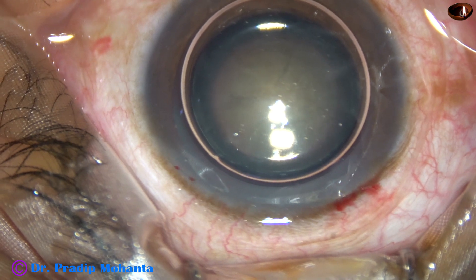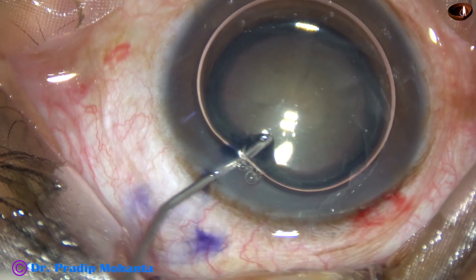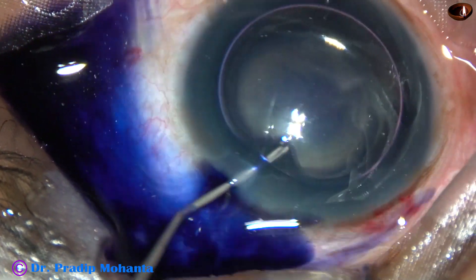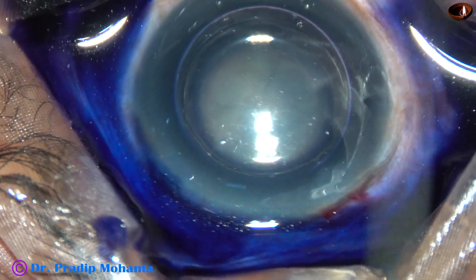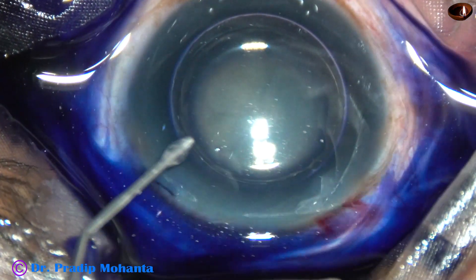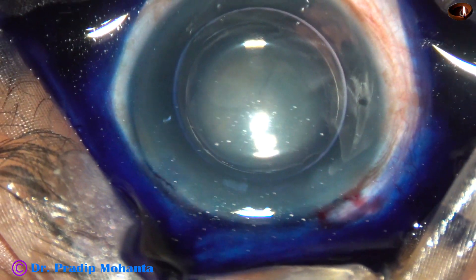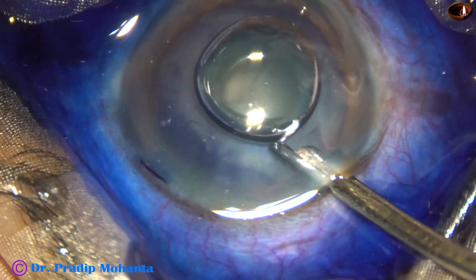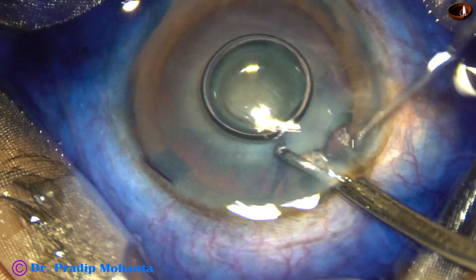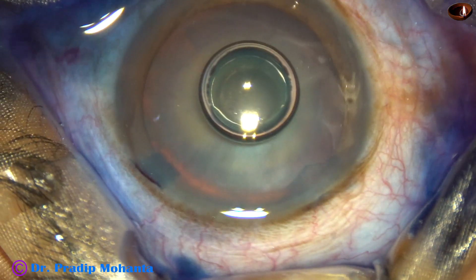Beneath this air bubble, Trypan Blue dye is applied over the anterior capsule. If you apply the dye beneath an air bubble, the dye is not diluted by aqueous and staining becomes very fast. The dye is washed out with BSS.